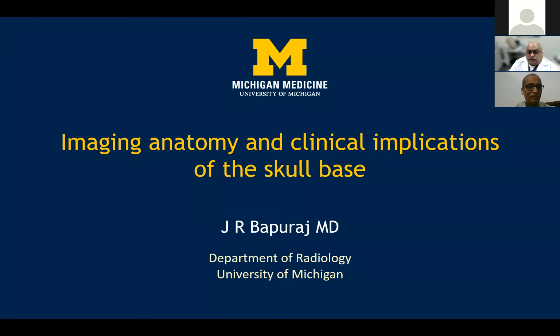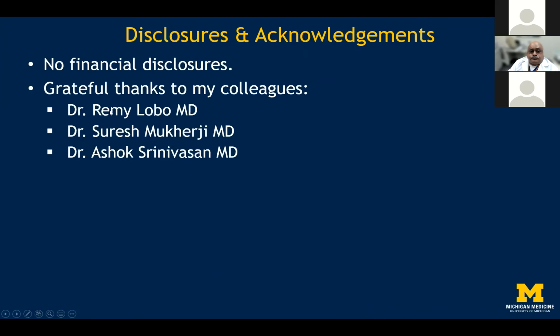give you this opportunity here to share with you an introduction of the imaging anatomy and the clinical implications of imaging of the skull base. Now, skull base is an important aspect of imaging of the head and neck.